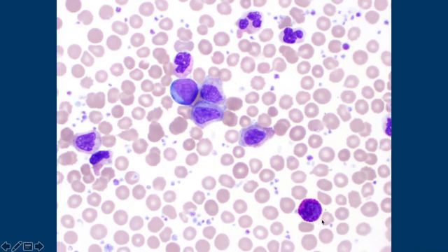So that's a basophil. Oh, I thought that was a good EO. Remember the basophil I showed you before, the granular basophil? Only I had looked at it a little cross-eyed and it's degranulated. So that's more of a purple than that Barbie pink. Neutrophil probably either.